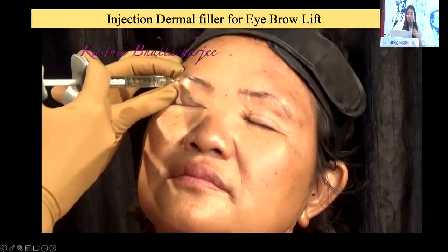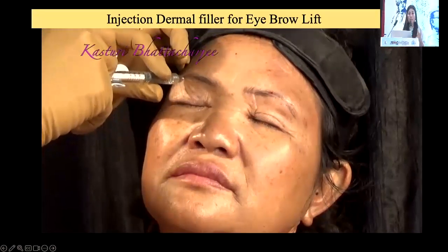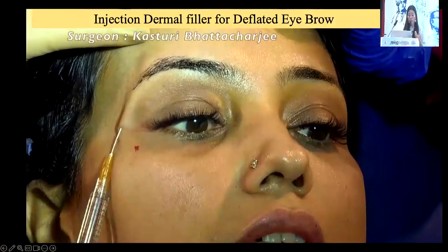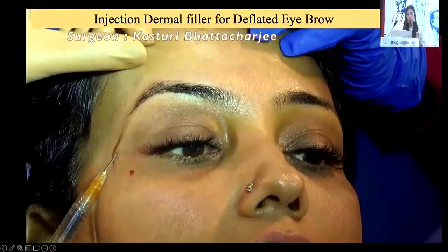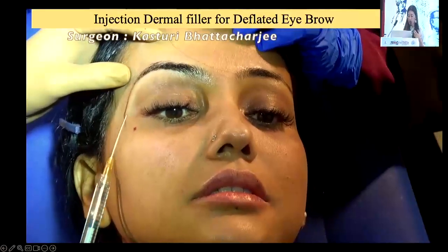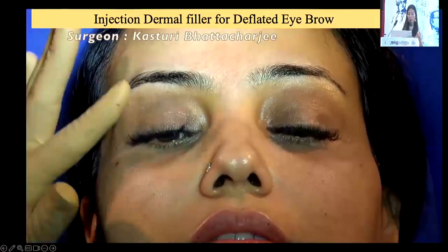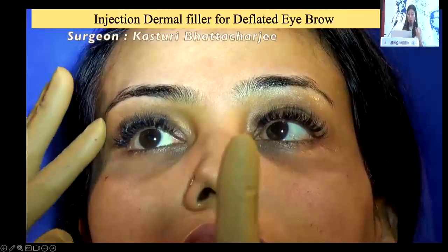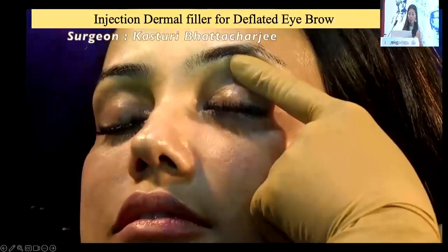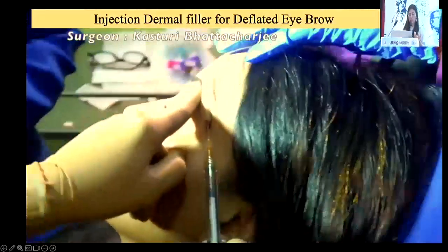My voice is gone. A brow lift is also a procedure where you can use the dermal filler, especially in those type of deflated brow. It can be done with needle and it can be done with a cannula. I prefer a cannula because I feel that a cannula is safer, and this, she's so young, but she has got so much of deflation around the eyebrow region, and being a very prominent personality, so I've used a cannula to correct this deflated eyebrow.